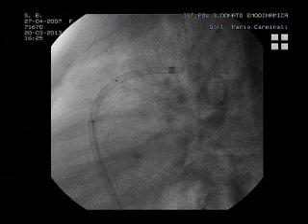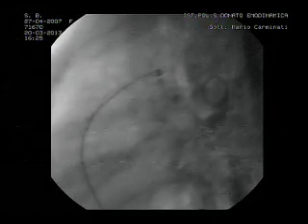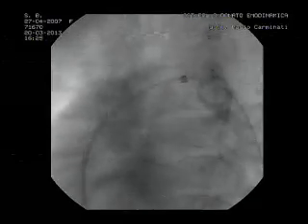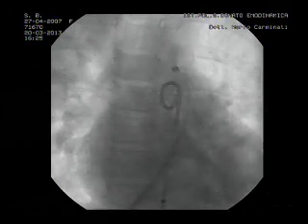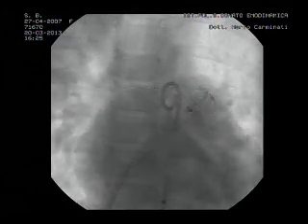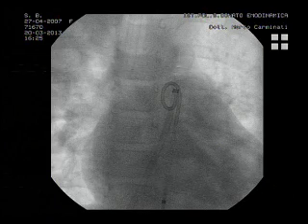And so probably an ADO1 larger size will be okay. What do you think? I think it's a good choice. An ADO1. Larger size. What size are you talking about? An 8-10? What's wrong with an 8.6? We've been using a. You have a complex of inferiority, Chair? Mario. Yeah. Mario. Yeah, in the United States, we would use the ADO1 LS. Larger size. Hang on, John. I'm just going to ask John Cheetham, would he put a covered stent in this duct?